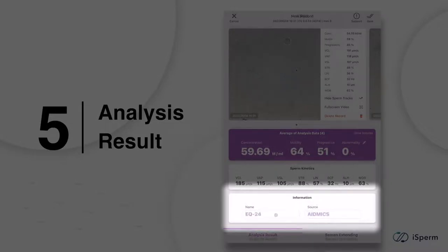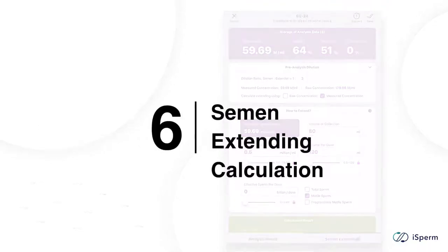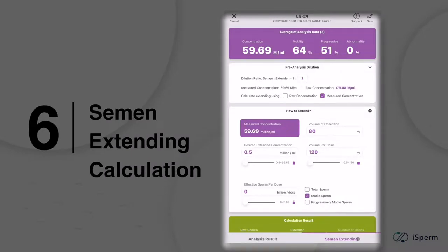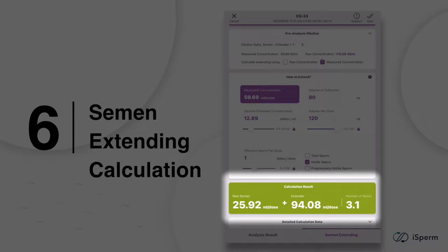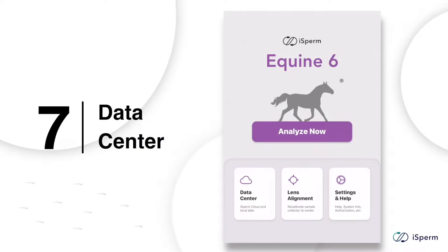To save the data and keep track of sperm quality of your male animals, fill out the animal ID or name and the source, such as the name of your property or farmland. For those who need to ship or pack semen, this page calculates how you should extend semen to get the most out of your collection. Fill out the columns to set up your desired conditions and you'll know right away how many doses of semen you can obtain by applying how much extender volume.